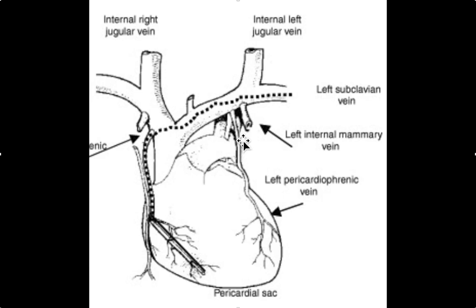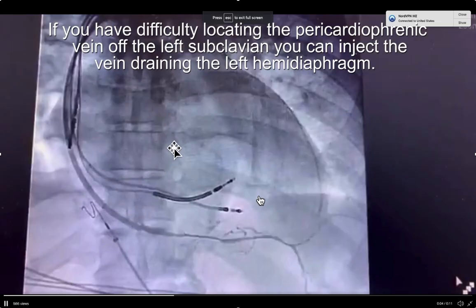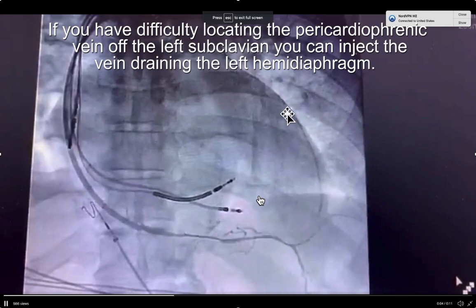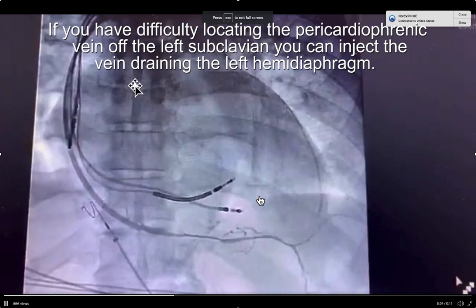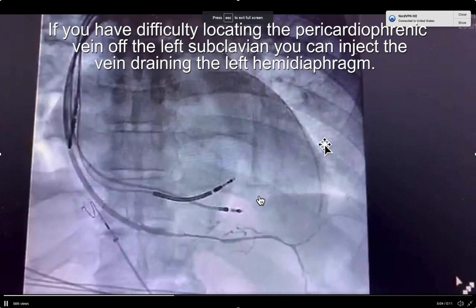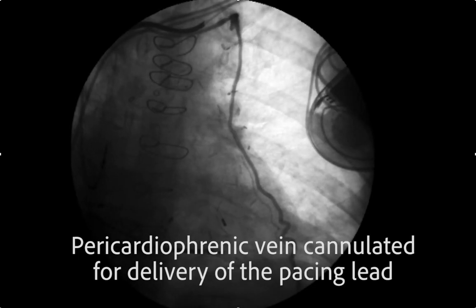Here's what it looks like — here's the left pericardiophrenic vein, and the idea is to get a lead to go down the vein. What I found is that if you have difficulty locating the connection of the pericardiophrenic vein to the subclavian, you can inject the vein draining the left hemidiaphragm and then follow it back up to see where the pericardiophrenic vein joins the subclavian.